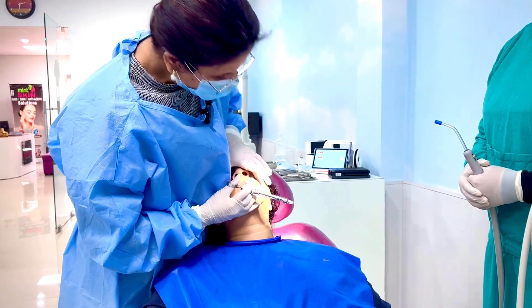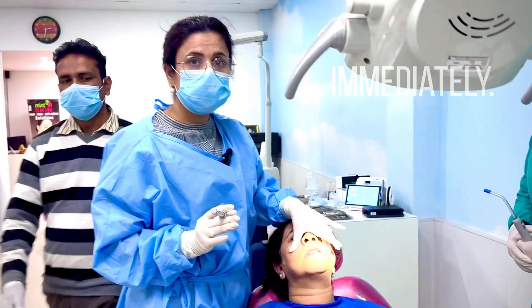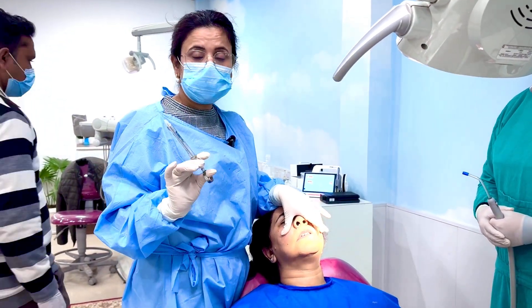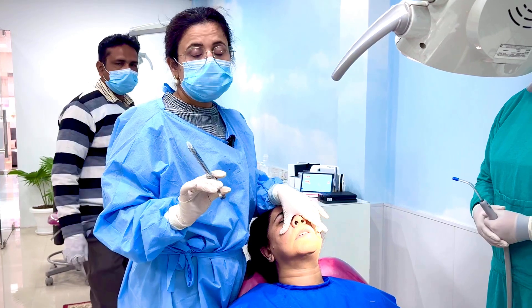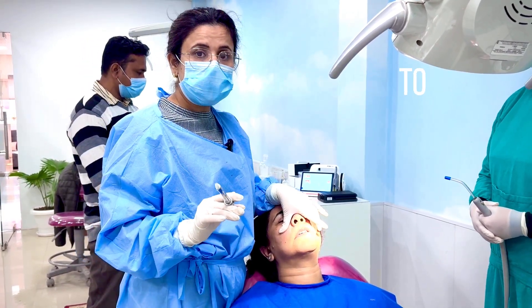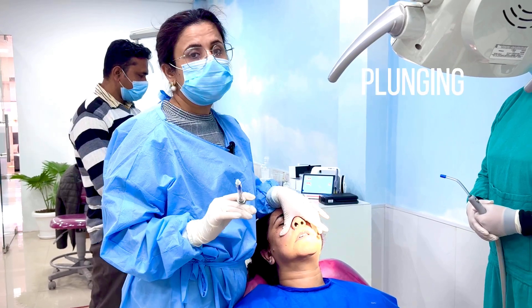You have to press immediately because the plexus there might bleed. Although these are self-aspirating syringes, if you are working with a conventional syringe, you have to aspirate before plunging in the local anesthesia.